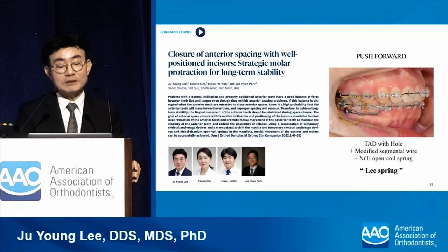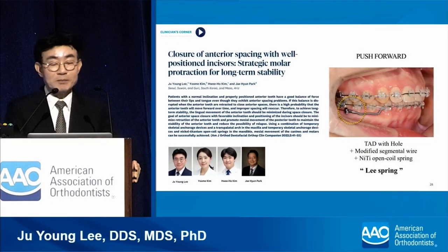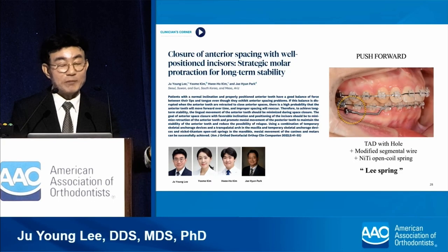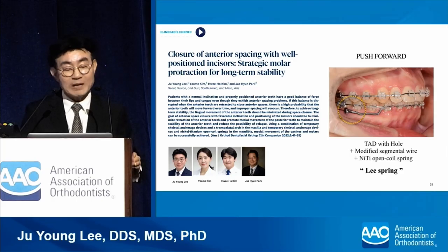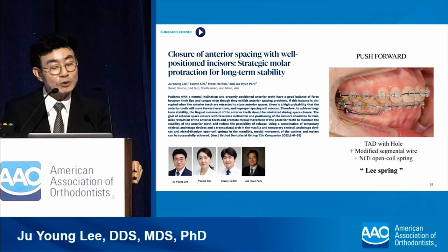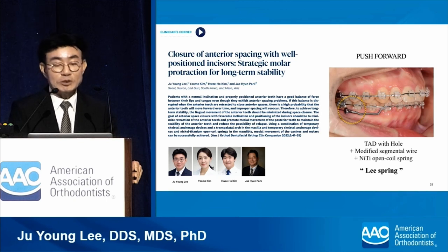To prevent this side effect, I recommend using a pushing force instead of a pulling force from the TAD. Instead of manufacturing a whole new product, I prefer utilizing already existing products to develop a new treatment modality. This way, new techniques can be applied more simply at a low cost.